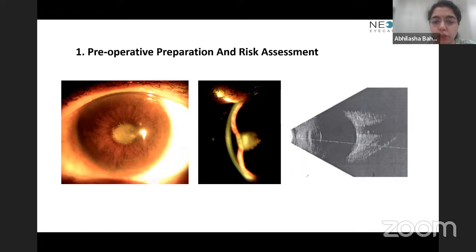So when there is no view of the fundus, you can still assess the level of inflammation by doing an ultrasound B scan. If the vitreous cavity is clear, make every attempt to look at the choroidal thickness. Even if there is no vitritis, a thickened choroid indicates an active case of uveitis.